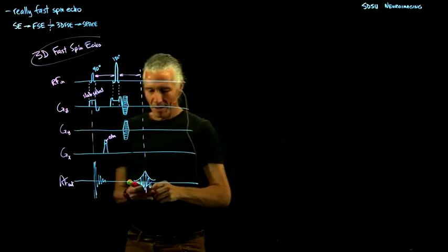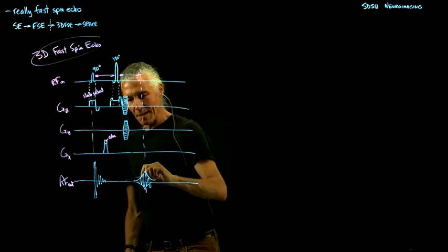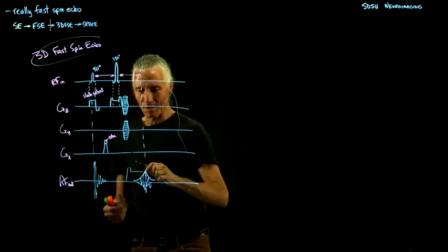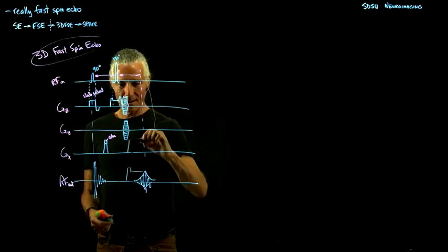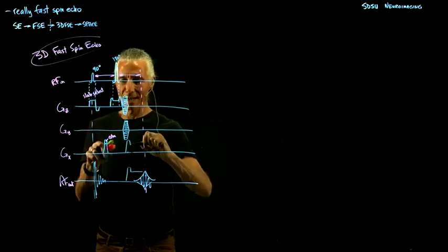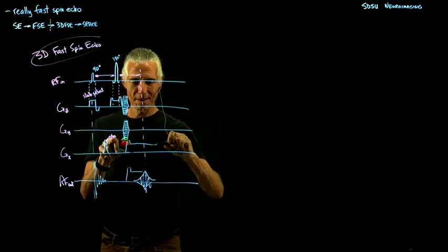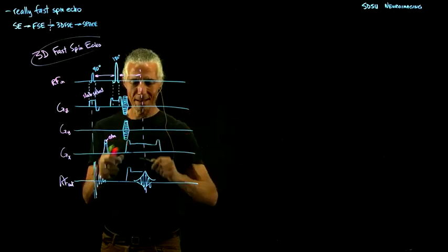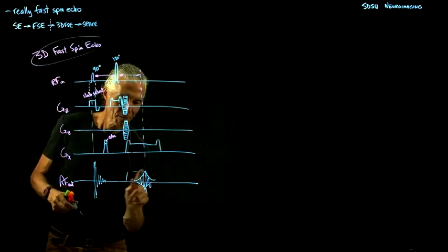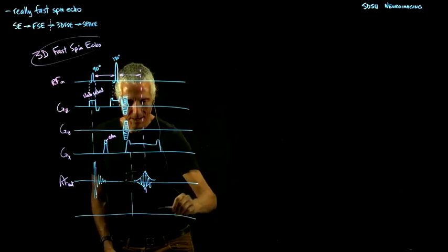And so then we're ready to record some data, and usually what people do is they've got another little crusher on this guy. So let's put a little ear on this one. Since we had a 180, it kind of fixes up this extra business here. And we go across and then put another little crusher like that. So that's our readout.